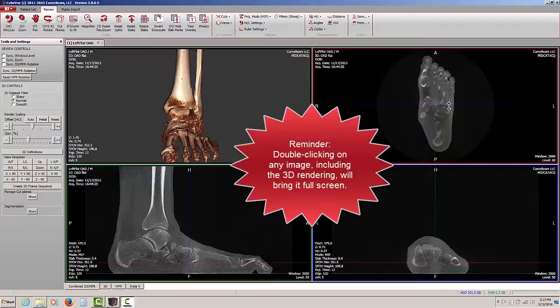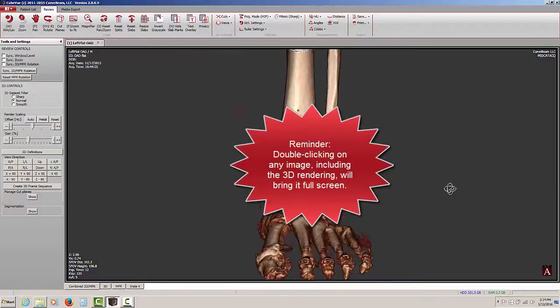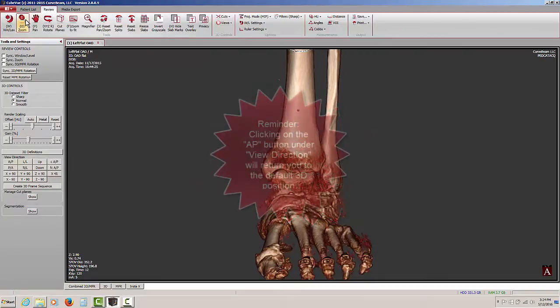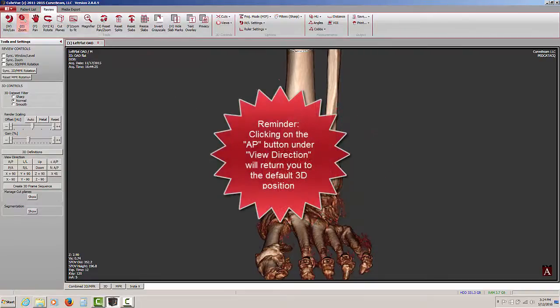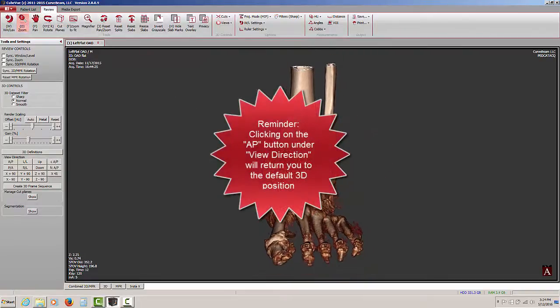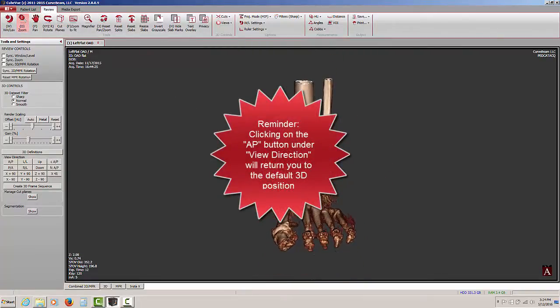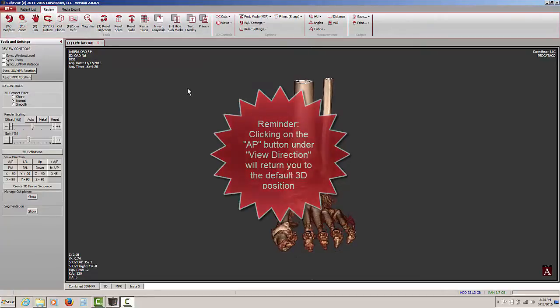Just a reminder, like any of the other three MPR views, you can always double click on the image in the 3D rendering window and you can make it go full screen. You can also zoom in or out to better work with the 3D rendering.